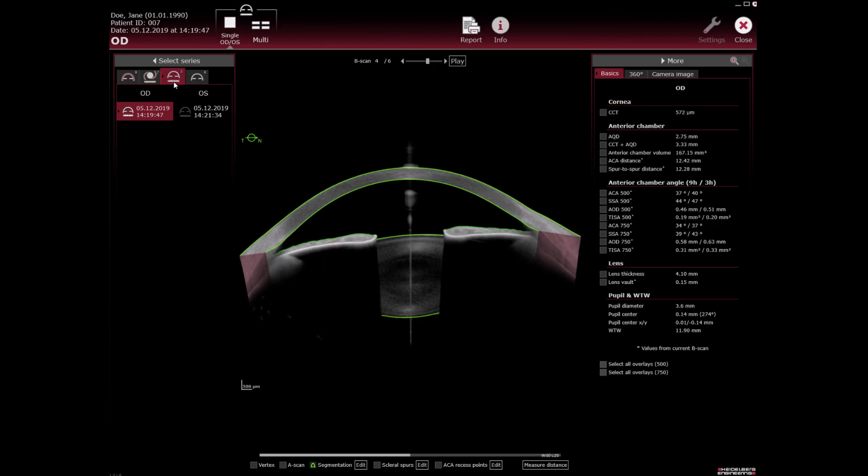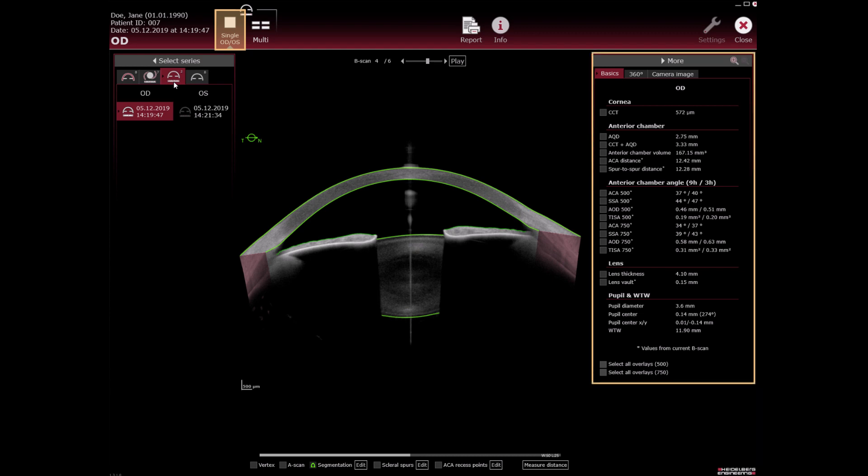Metrics application. Single view of the most current acquisition OD is shown with the relevant parameters for this scan in the more section. Multi-view is available.